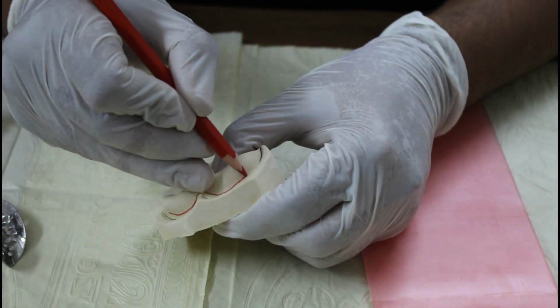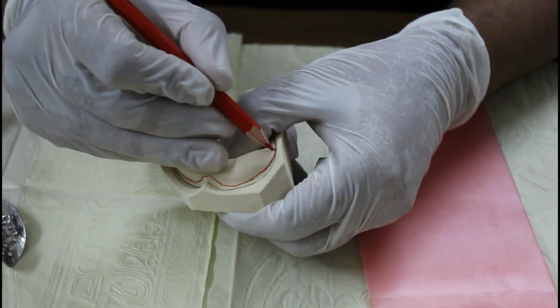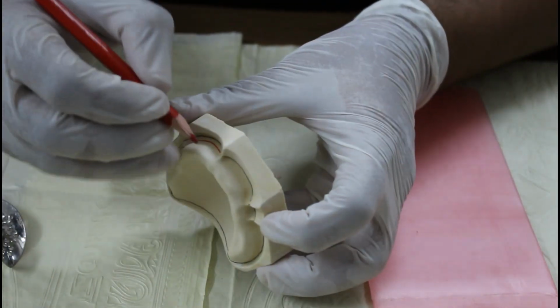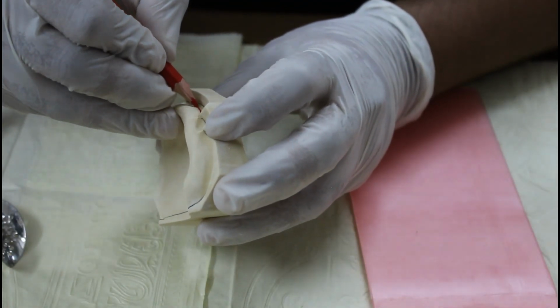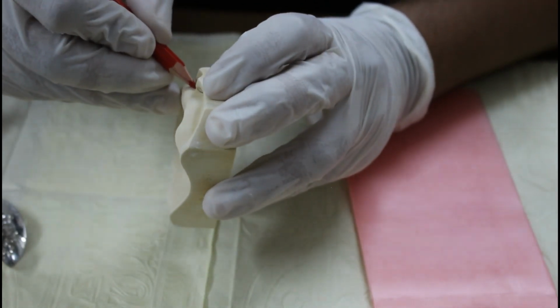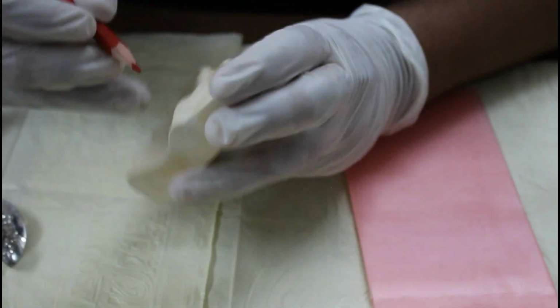This line will extend and posteriorly it will end in the hamular notch. It will stop here. Then anteriorly draw this line again 2 millimeters above. Let it go up in the frenum areas.